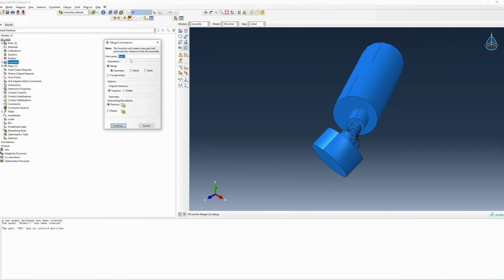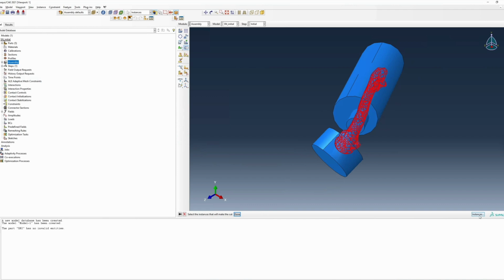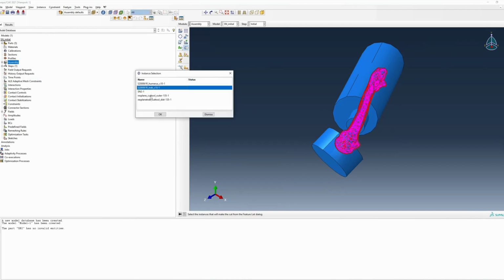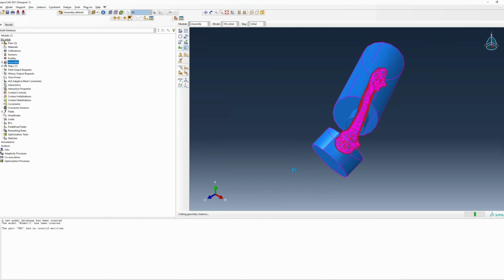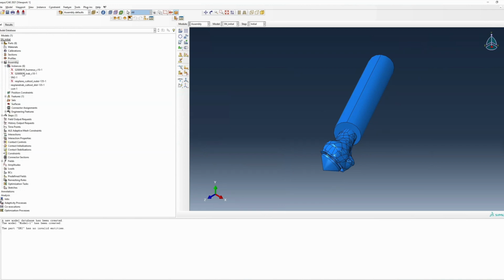As we begin our in-silico resection procedure, ensure that all your cut tools are properly positioned. Under the assembly module, cut your geometry and suppress the original instances. If you're planning on breaking up trabecular and cortical bone, I would probably suggest that you start off with a full bone model and a trabecular bone model. By subtracting the trabecular bone model from your cortical bone model using a Boolean subtraction, you'll be able to achieve a thin cortical shell without worrying about any kind of work in Mimics, as the reducing and wrapping features of Mimics are sometimes a little bit difficult to work with.